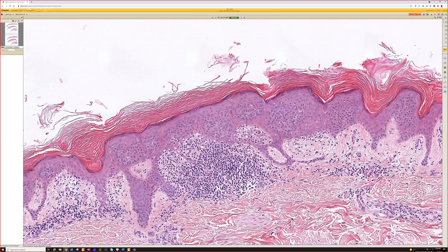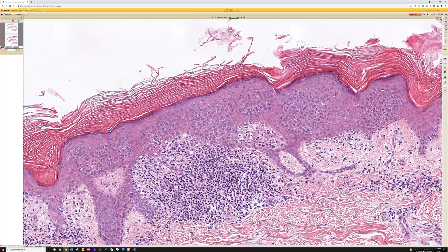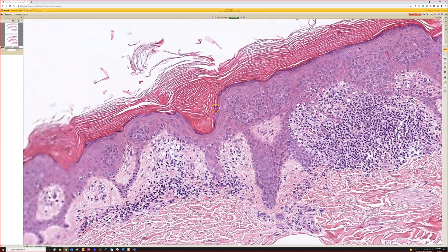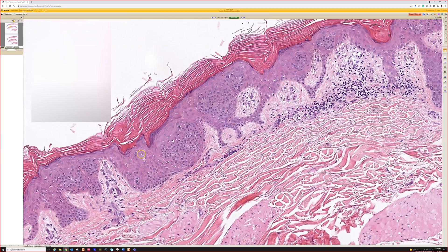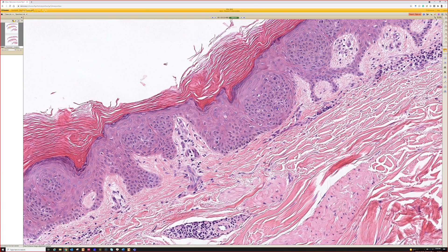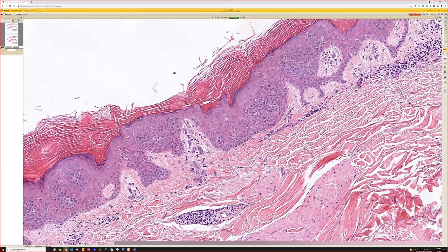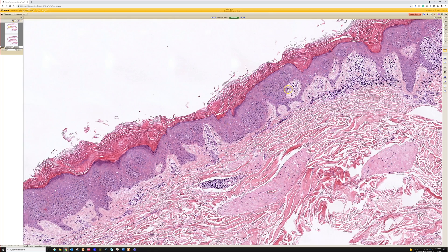Usually it's easy to recognize, but sometimes the clones look very striking and very discreet — like these little nodules look very cut off from the rest and give you right away that feeling of, ooh, squamous in situ, and get you worried. So they can be really sharply demarcated, but most of the time if you look around you'll find other areas that look like obvious seb.